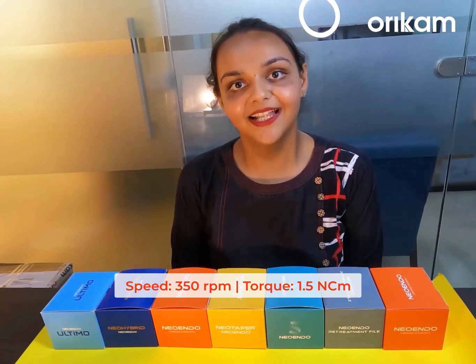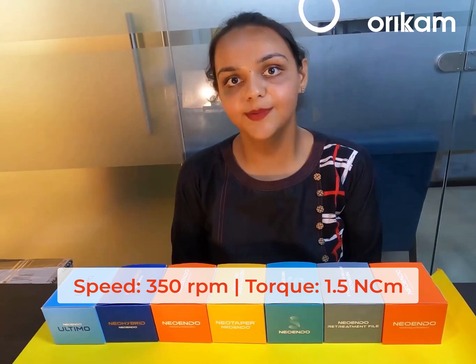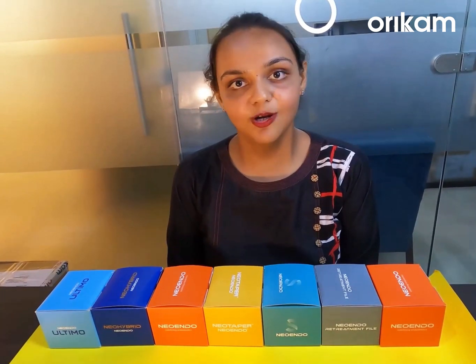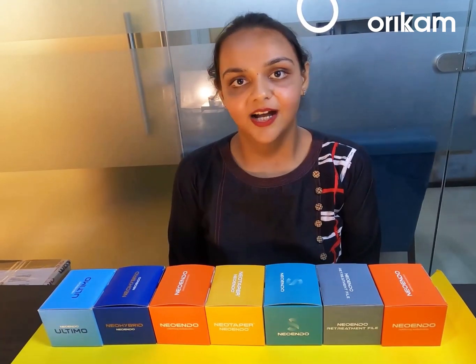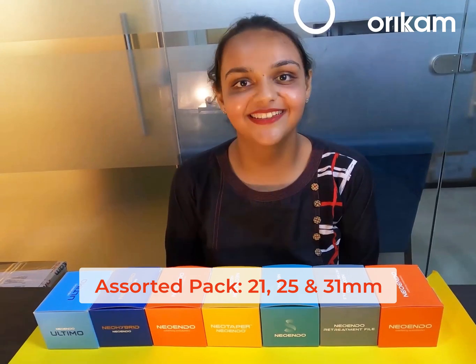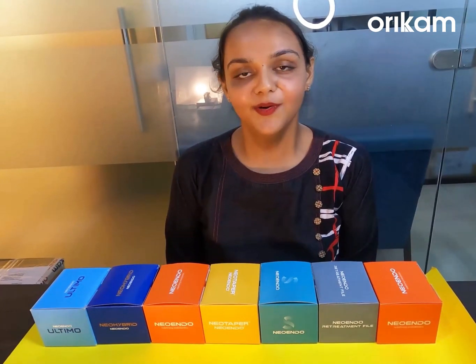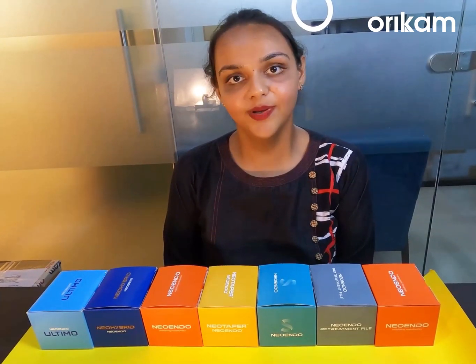The recommended speed and torque of this file is 350 rpm and 1.5 Ncm torque. Coming to the packaging of this file, it is available in refill and assorted packs. Assorted packs are available in 21 mm, 25 mm and 31 mm length. It is available in 31 mm length as well. NeoEndo Flex file also comes as a large assorted pack where you get all the higher sizes in 4% and 6% taper.